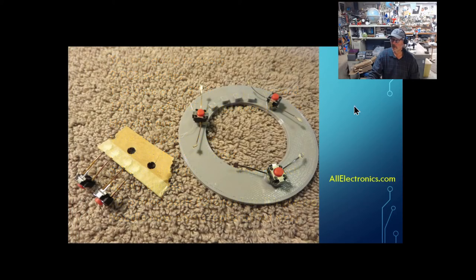So, once you get the 3D printed part done, this base here, you're going to have four pieces. At least each switch has four pieces. And this piece, this ring here, this is the one you mount the switches on.